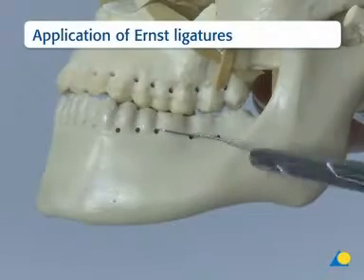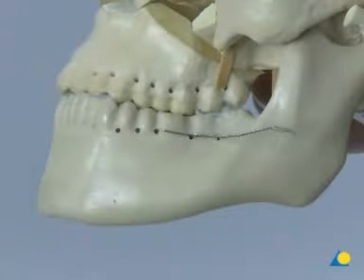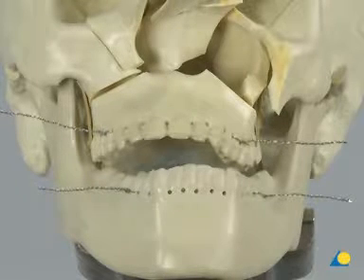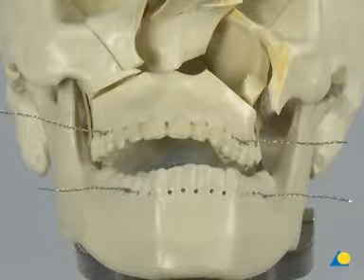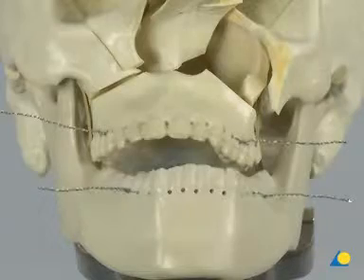In a clinical setting, arch bars are usually applied to the teeth. In this exercise, Ernst ligatures are used to simplify the procedure. Maxillomandibular fixation (MMF) is not achieved until after the exposure and mobilization of the maxilla.